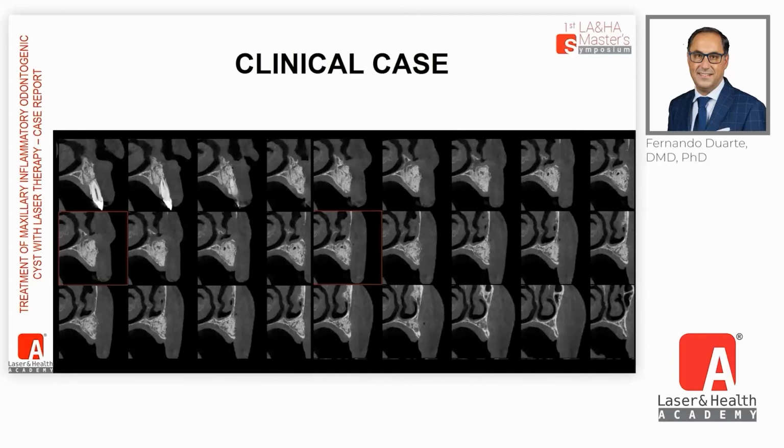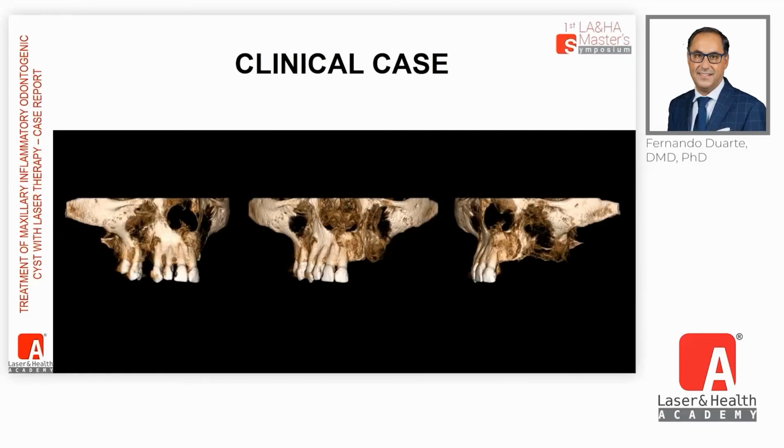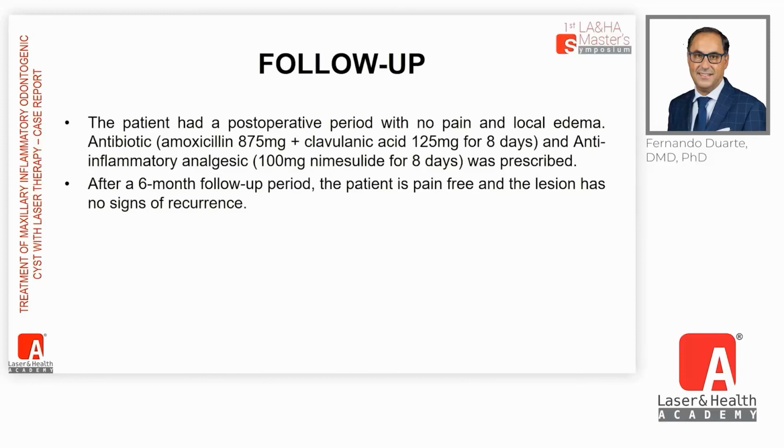And here, the cuts, you see the bone density occupying all the space. 3D images from the bone reconstruction. And our follow-up. The patient had a post-operative period with no pain and local edema. Antibiotic and an anti-inflammatory analgesic were prescribed, and after 6 months of follow-up period, the patient is pain-free and the lesion has no signs of recurrence.